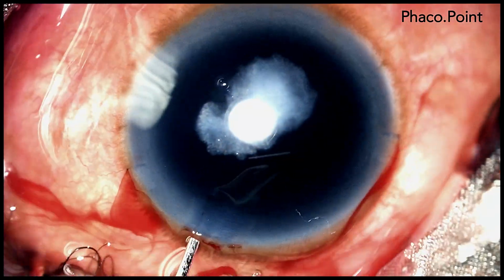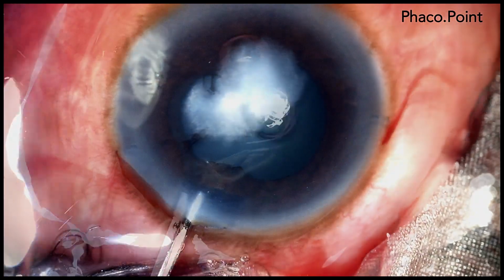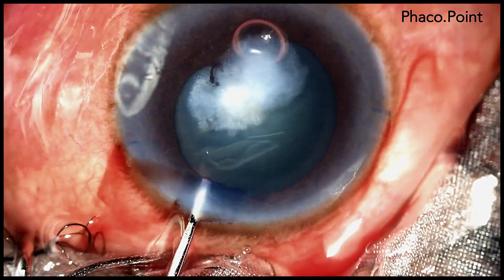We need to take adequate time to stain the anterior capsule because the stained anterior capsule affords a lot more visibility while creating the rhexis, especially in a case like this where you have an overlying corneal opacity.